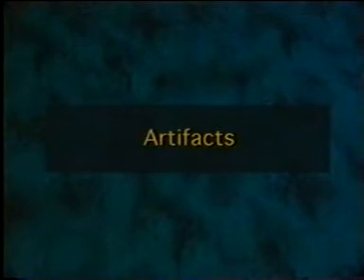Another very important subject is artifacts. This really is applied physics in a way, but it's a very important cause of false positive diagnoses if you don't recognize them for what they are.